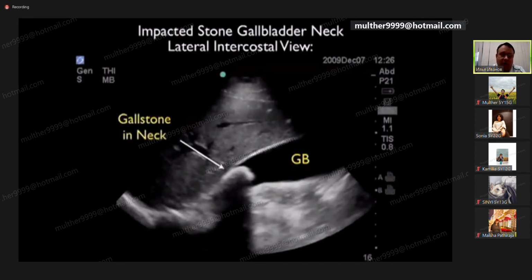Distal acoustic shadow is the absence of the reflection, because the material of the stone, its cholesterol crystals, is a full block for the ultrasound waves, and the black color behind the stone is the absence of information. The same problem we can find in the investigation of the bones. For example, investigation of the liver through the ribs. We need to use the space between the ribs, the parallel space between the ribs, for detection of any parts of the liver.